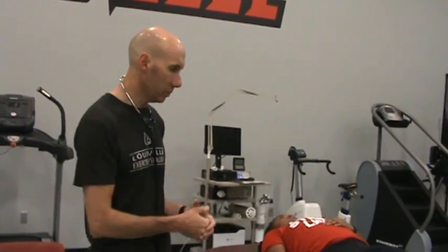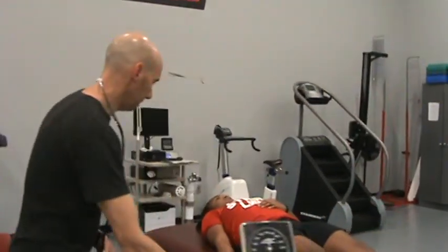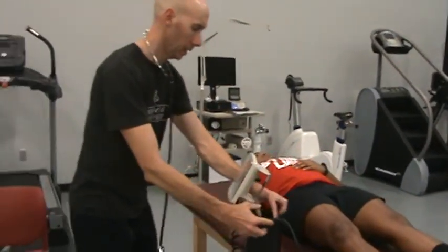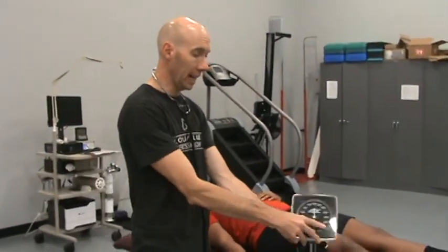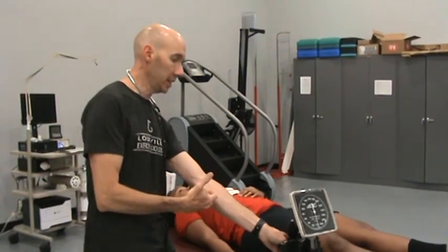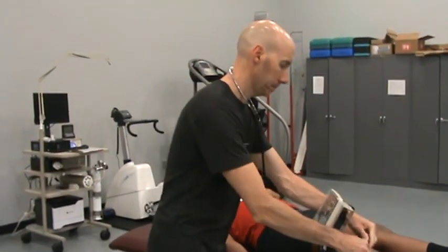Typically, as with most other measurements, you're going to measure everything on the right side of the body. So on Lindsay's right side here, I'm going to move my cuff into position. You want to make sure it's positioned where you can see it, right? You don't want the device facing this way, because when I'm taking the blood pressure, I won't be able to see the dial. So you want to make sure it is facing you.